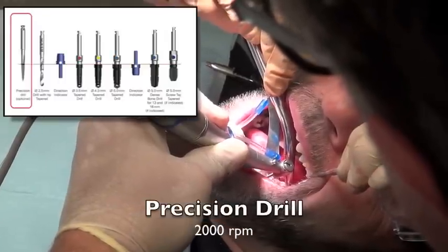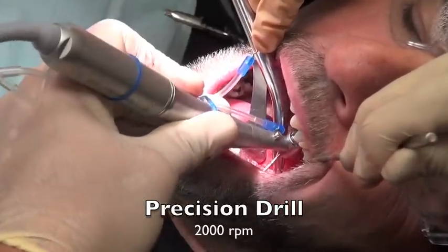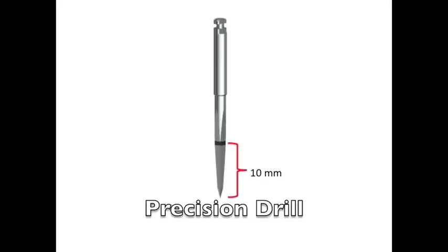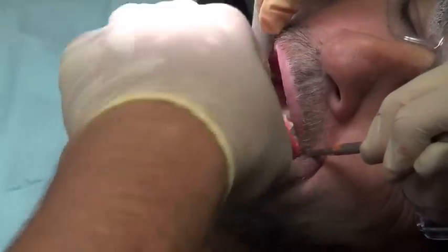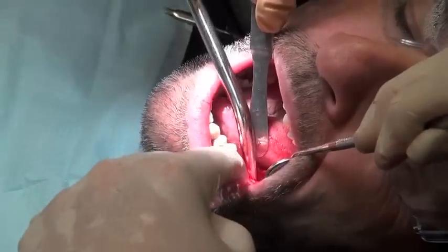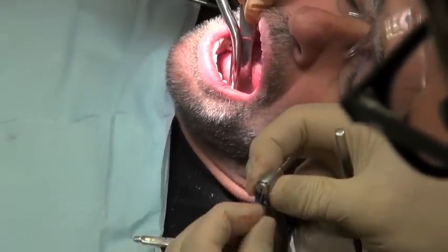We start with the precision drill on the surgery — this helps us to get a pinpoint accurate spot. So we go through our stent, making sure we're denting into the ridge itself. Taking it out, we can check to make sure we're in a good location based on our CT scan. It looks good; I'm checking it and making sure we're in the right spot.